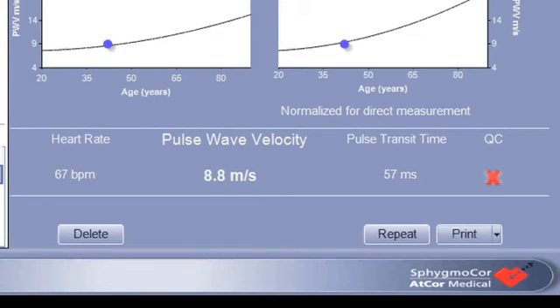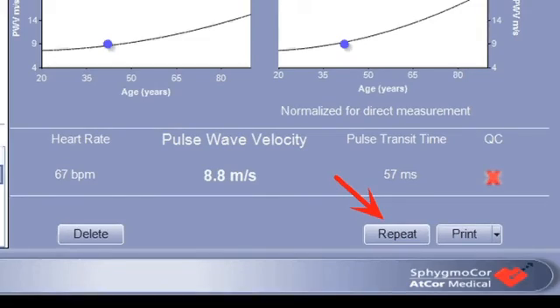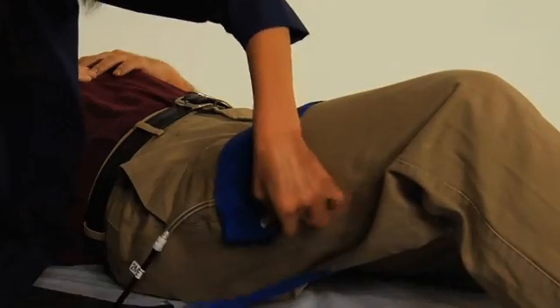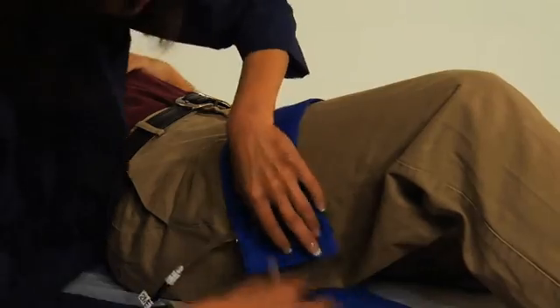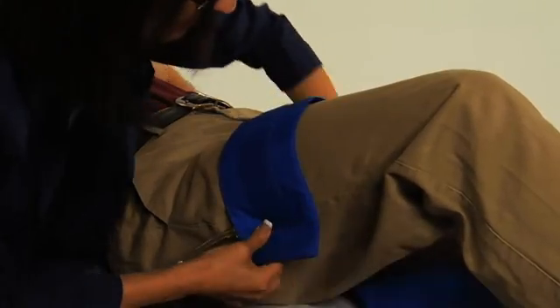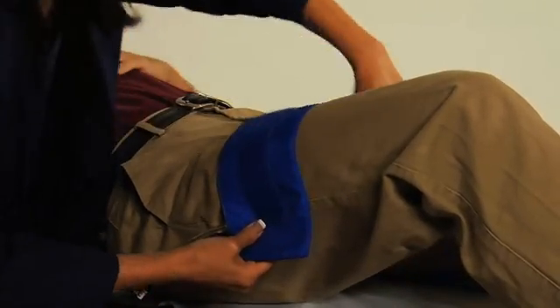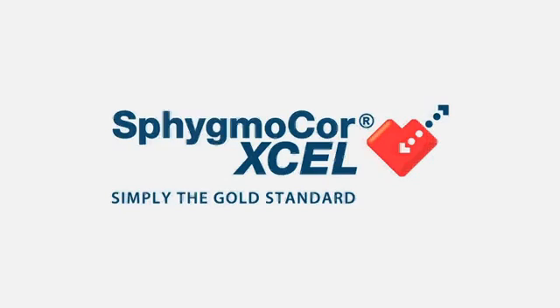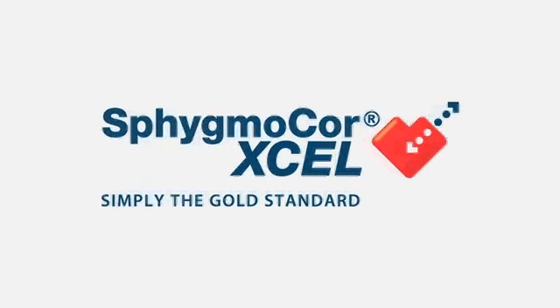If a red cross appears on the screen, the measurement should be repeated. To repeat the measurement, simply click on Repeat at the bottom right corner of the screen. Once an acceptable report has been obtained, the measurement is complete and the cuff can be removed.